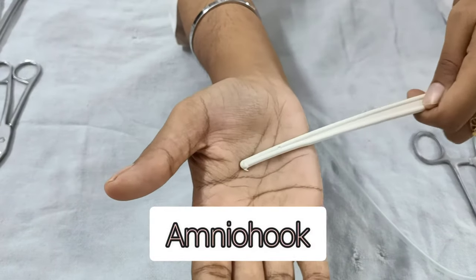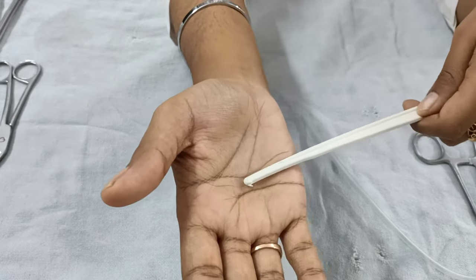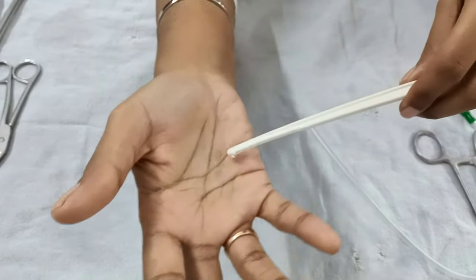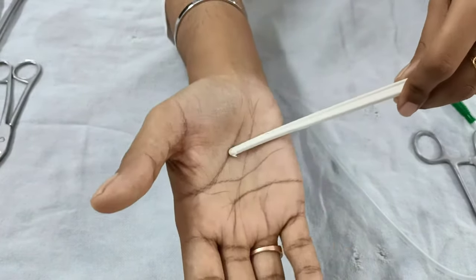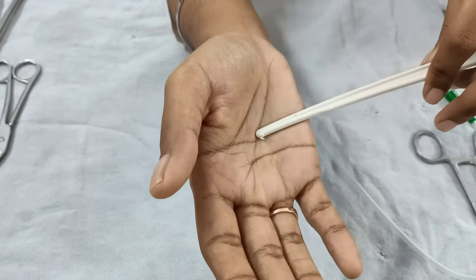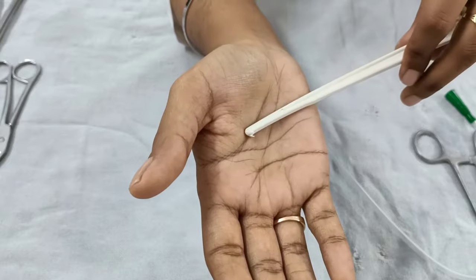Next we have the amnio hook. It has a sharp pointed edge at its tip and is basically for the artificial rupture of membranes. Artificial rupture of membranes can be done early in labor, around three centimeters dilatation when the fetal head is engaged. Indications include suspected abruptio placenta, suspected meconium, or to augment labor.